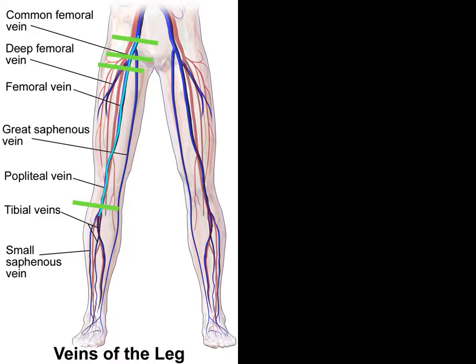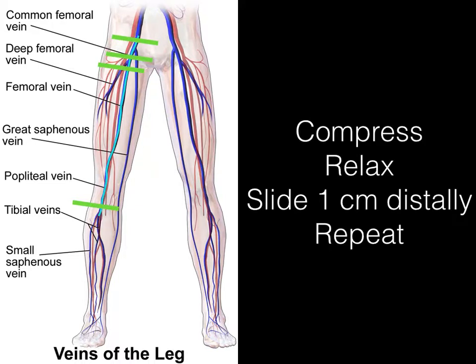What's the process that we do? Well, we're going to compress, then we're going to relax, we're going to slide distally, and we're going to repeat the whole way down the leg.